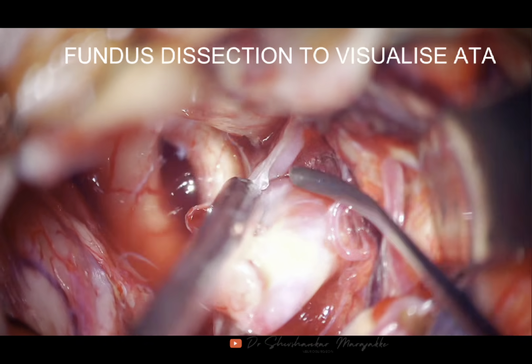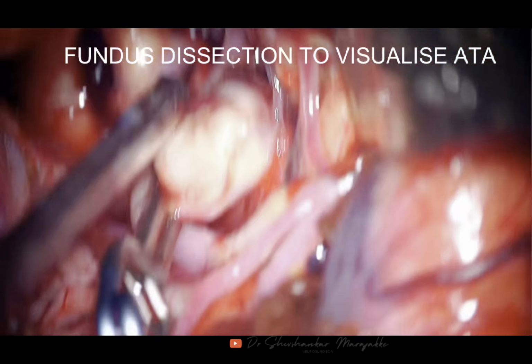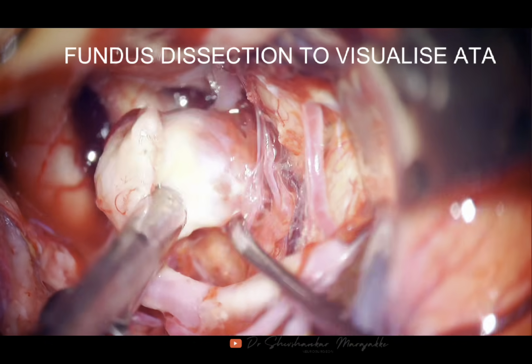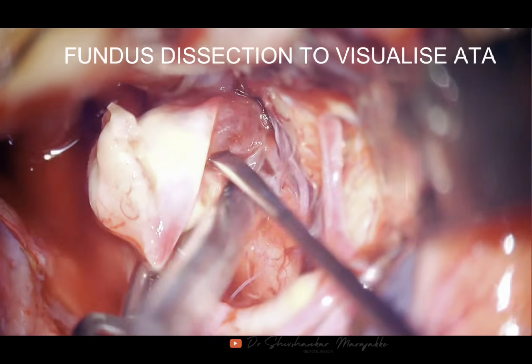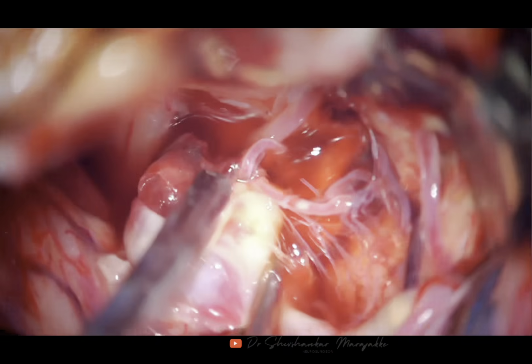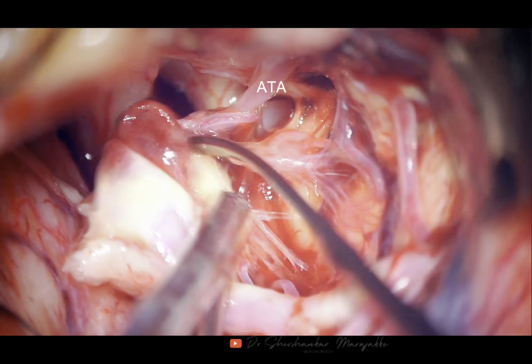So I am dissecting further here. So that is the antetemporal artery being dissected from the fundus. So this manipulation I avoided in the beginning because that might rupture the fundus. So you can see that there is a ruptured teat of the aneurysm there, that is the ruptured part. For this reason, we avoided exposing this part before applying the clip. So I have applied the clip, so my neck is secured.